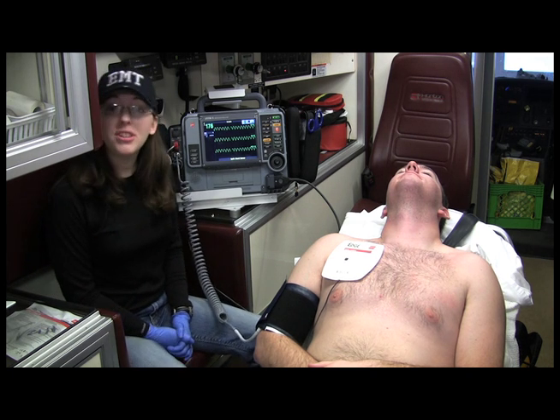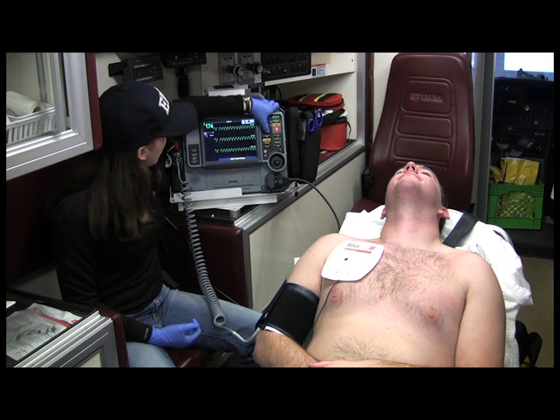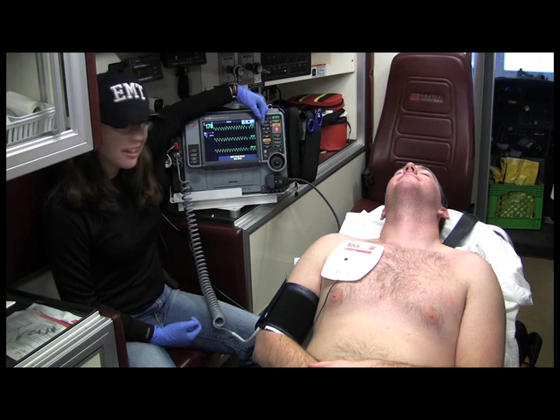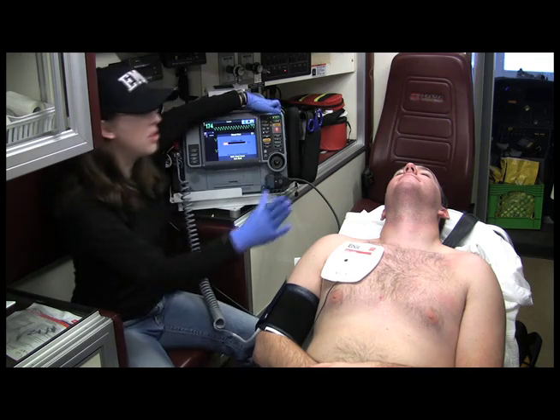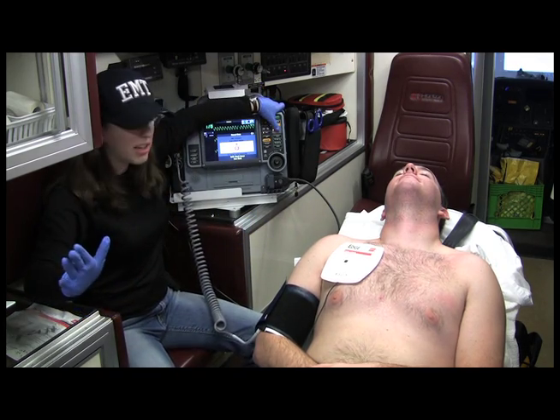So we are ready to synchronize cardiovert. I already have my appropriate joules. I want to sync. I am seeing my little flashing light, I am noticing my triangle, so we are syncing correctly. Go ahead and hit charge. Are you clear? I'm clear. I'm clear. Everyone is clear of the patient. Going to hit shock.